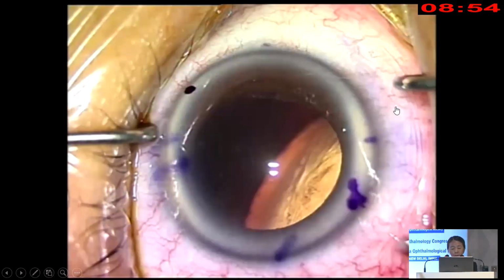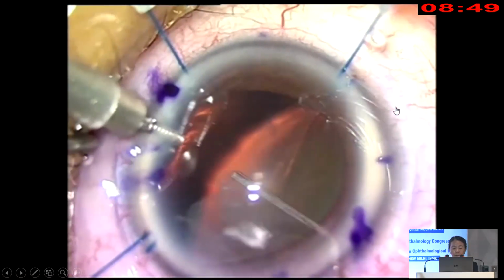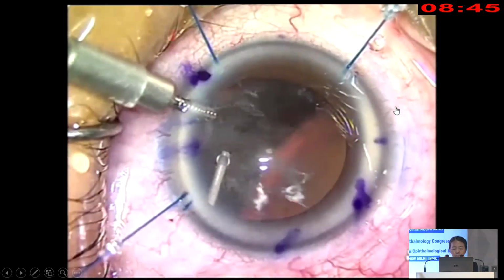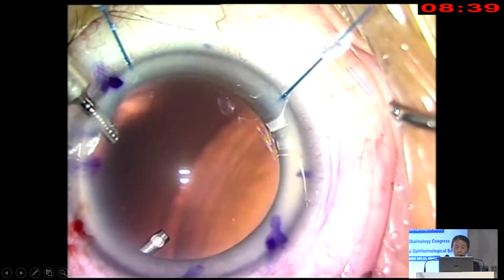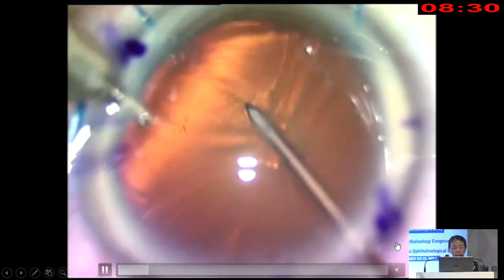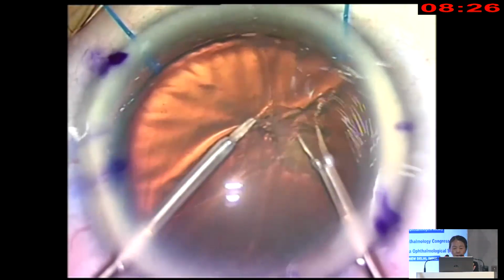Now this is a more difficult case. This is where you need to first start by clearing vitreous. Okay, so there's vitreous in the anterior chamber, and you know the vitreous is supporting the lens. And if you don't have a couch, actually you can just lie the patient between 2 chairs in your clinic. I remove all the vitreous that supports the lens, and I'm indenting, all right, with a cotton bud there, spear with a 27 gauge needle on the anterior capsule, and then lift it up. You can see I've got all my hooks ready.